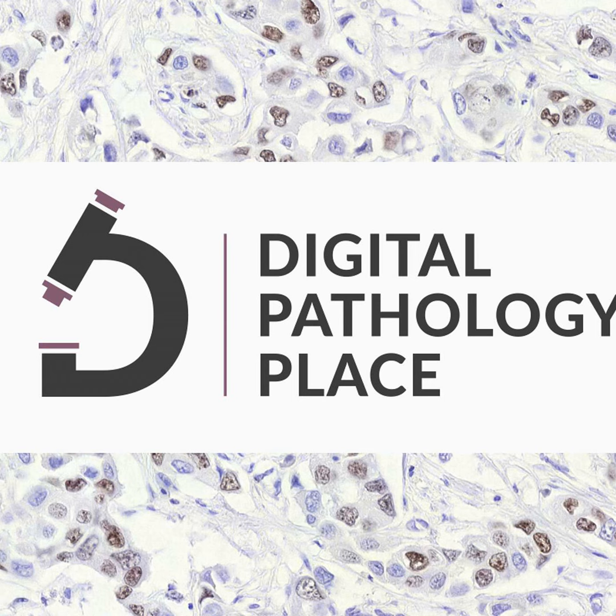But here, again, you have this molecular marker, the IHC marker, that is kind of an objective ground truth. Yes, exactly. It just happens to be easily distinguishable visually. If it was an immune cell marker, there is no way of distinguishing this visually, but you still have a ground truth. Assuming antibodies work and everything worked in the lab. Yes, that's also not always the case.